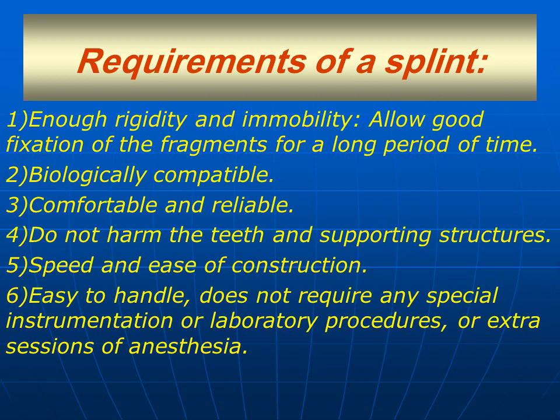Requirements of a splint. There are many requirements for a good splint. First, enough rigidity and immobility. That's to say, allow good fixation of the fragments for a long period of time. Biologically compatible, comfortable and reliable for the patient. Do not harm the teeth and supporting structures.